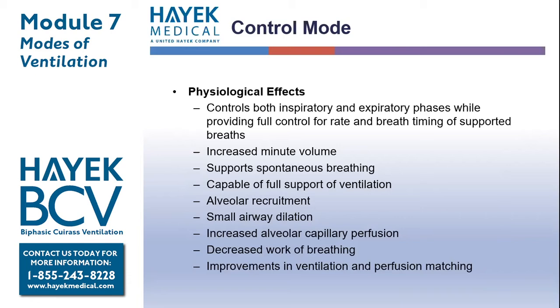Control mode supports increased minute ventilation, also supports spontaneous breathing with a bilevel pressure wave, capable of full support of ventilation, alveolar recruitment, small airway dilation, improves alveolar capillary perfusion, decreases work of breathing, and enacts improvements in ventilation and perfusion match.